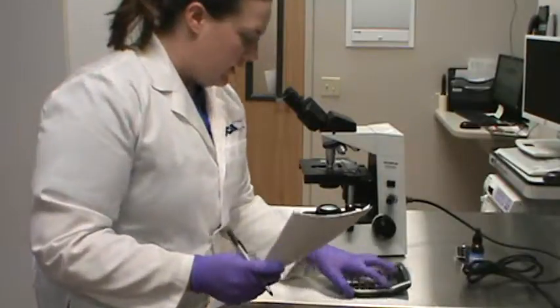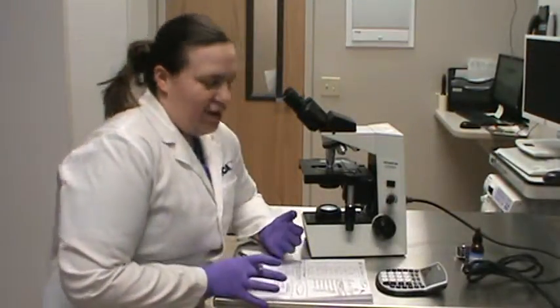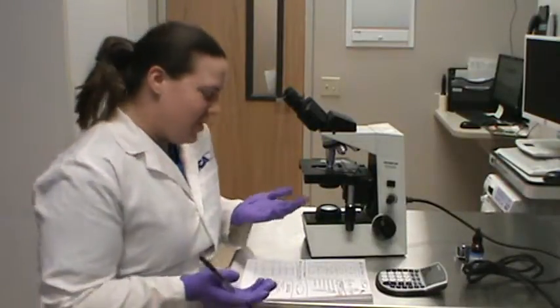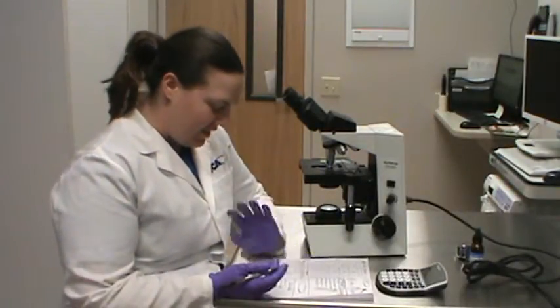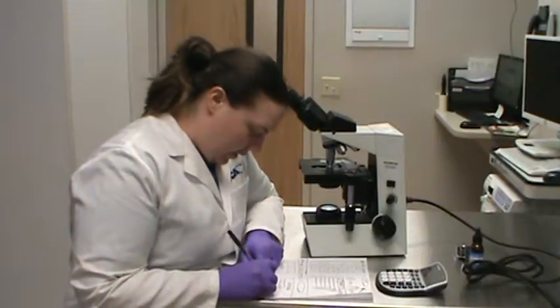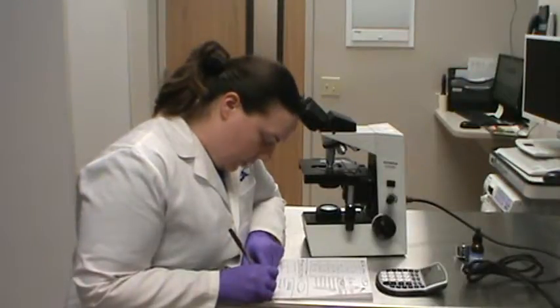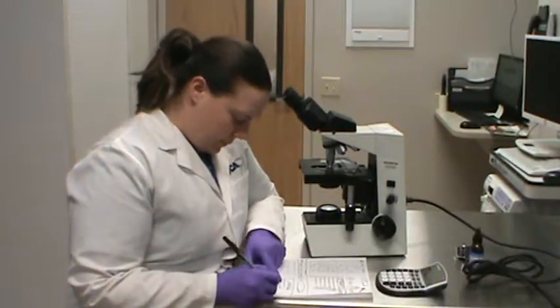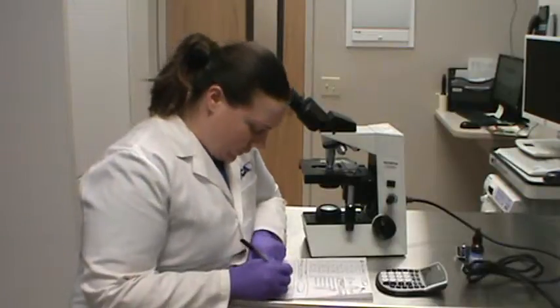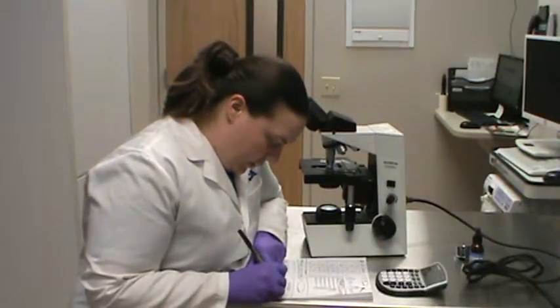As far as any morphology, it was relatively, how do you say, boring, which is good news for this friend because I didn't really see anything too concerning. There was definitely no platelet clumping at all, so I'm going to say none noted for platelet clumping. There was no anisocytosis from what I've observed, so none noted.